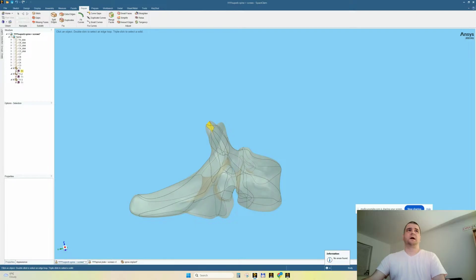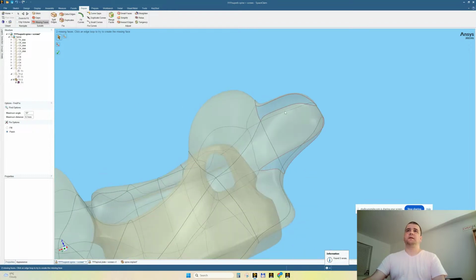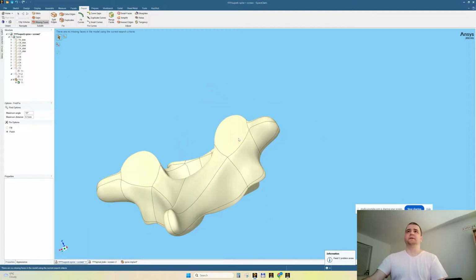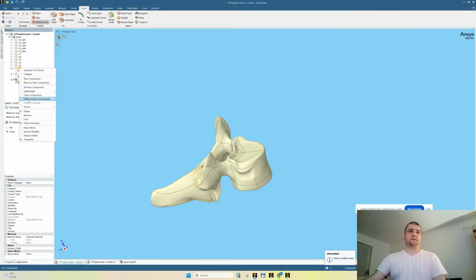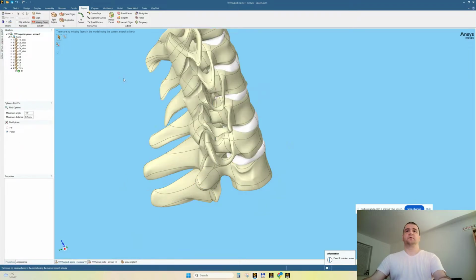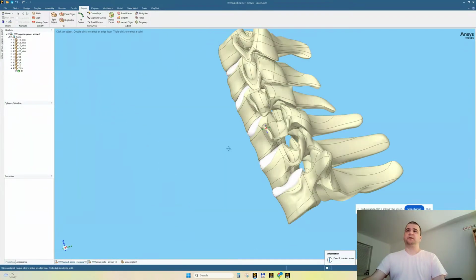Let's hide this face and this face, and let's see. They are found as missing faces. Let's see if SpaceClaim can replace them, can patch these missing faces. Oh, yes, it could. Perfect. This is 3D. Now, of course, we don't need these small surface patches. Let's delete them. Right click, show up. Now we have everything we need regarding the anatomical side.